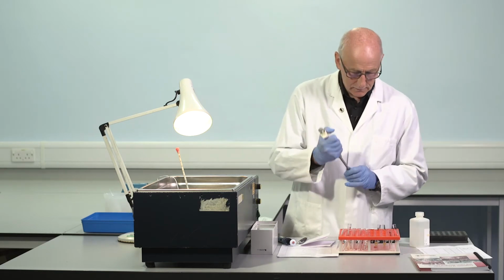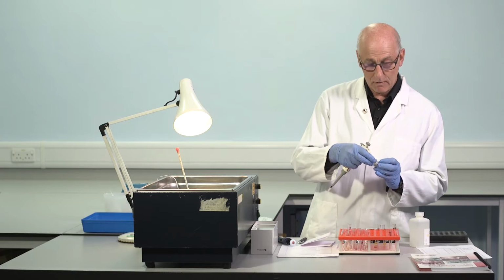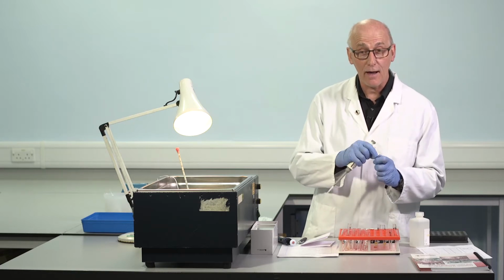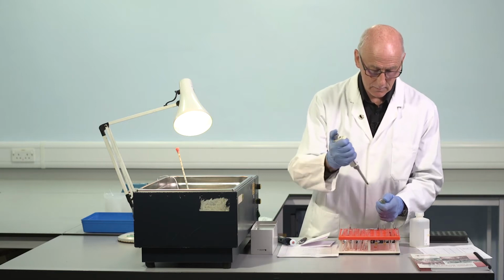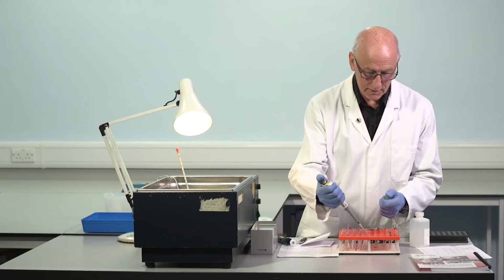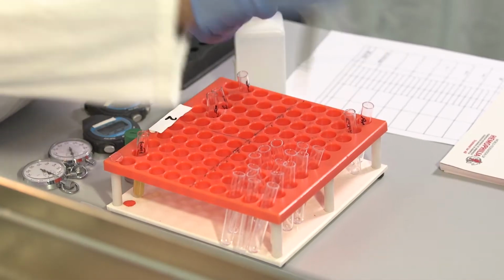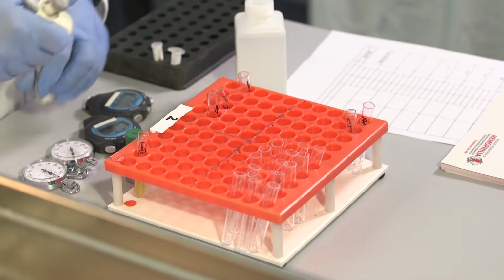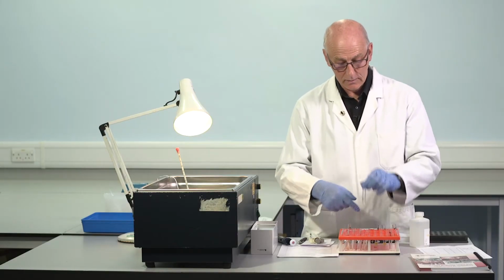Okay. So we'll add now 100 microlitres to 0.9, 900, 1 in 10. 0.1 to 1.9, 0.1 to 3.9. 1 in 10, 1 in 20, 1 in 40. And each of these should be mixed.